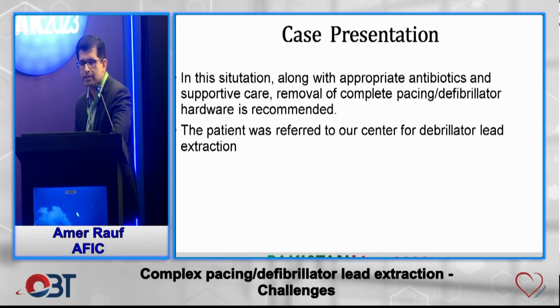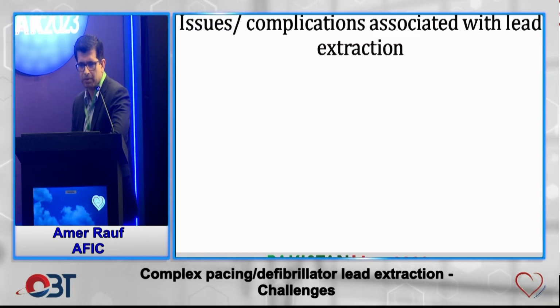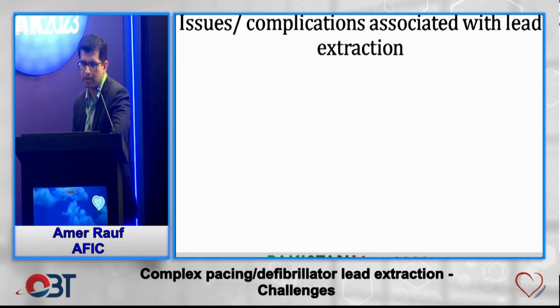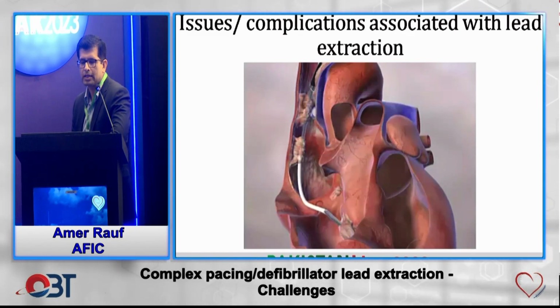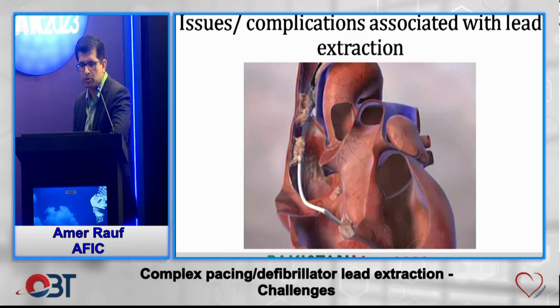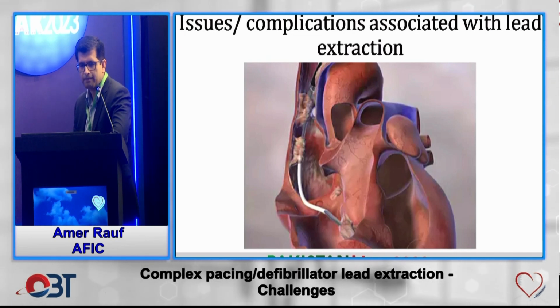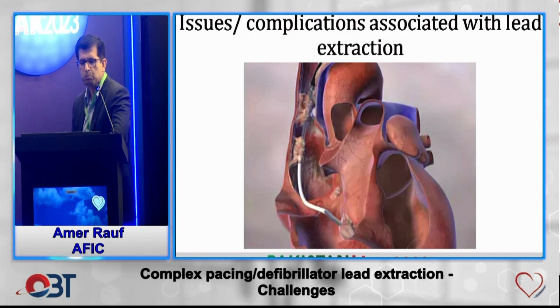Now, before I proceed further, I want to highlight why lead extraction is such a big problem, because we understand implantation, it's not such a big job, especially just the implantation part. But the problem with extraction is this, that with the passage of time, depending upon the time that the lead stays in the body, there is formation of tough adhesions between the lead and the endocardial surface of the heart and the vessels. Now, with the passage of time, these adhesions can also calcify, and in this situation, you can understand that it is simply not possible to pull the lead out of the body.